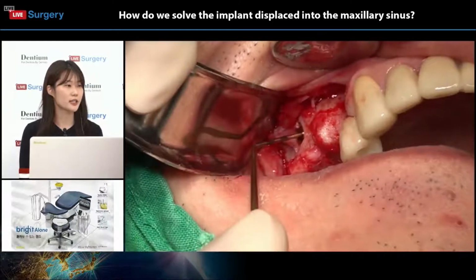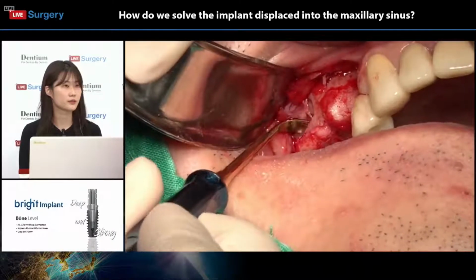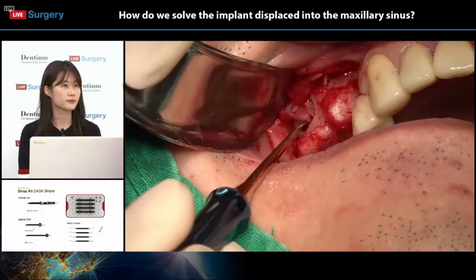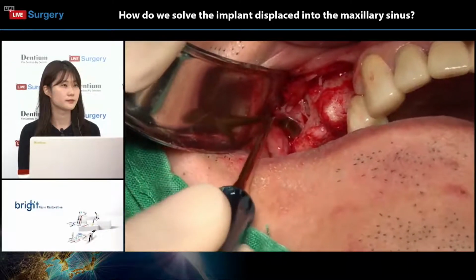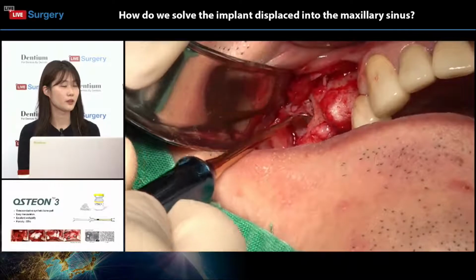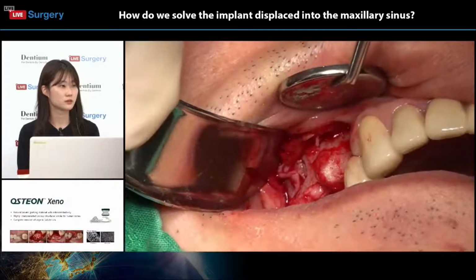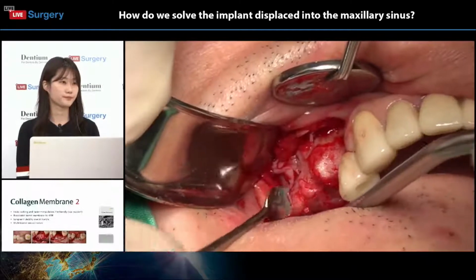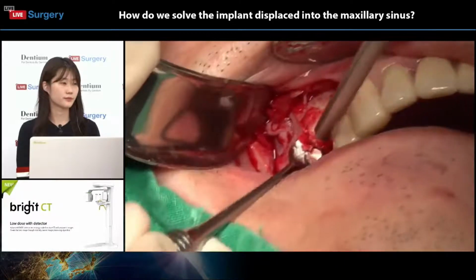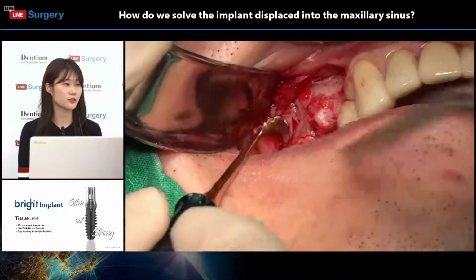For the next step, the surgeon is carefully detaching the sinus membrane from the bone. Unsupported bone fragments are being removed along with the granulation tissue.